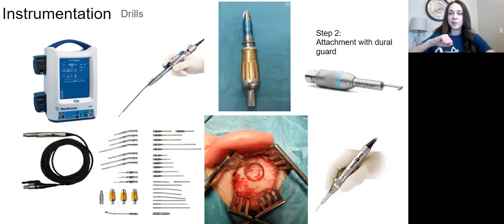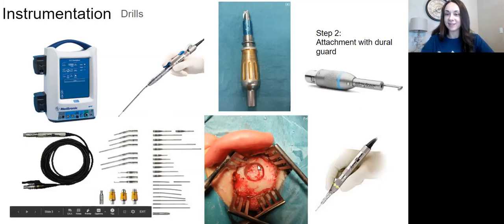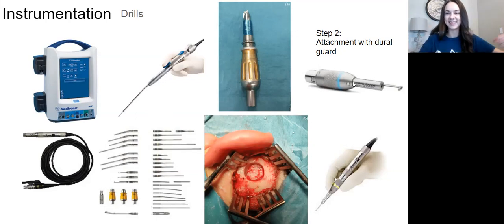This is what they're going to start with. So yes, you know the hand crank drill I just told you about. It's going to make the same circle. In surgery, not using the hand crank drill, regular planned surgery, it's going to be your surgeon's preference, but there's one of two options to start this burr hole. So what I'm used to is this handheld electric drill. We make a burr hole, we make another one, then we flip to the side cutter to connect the dots, and then take the bone flap off.